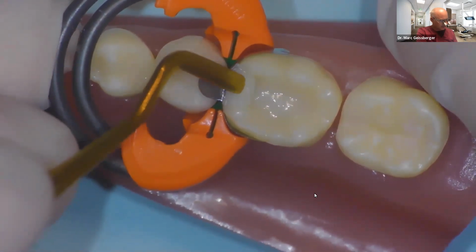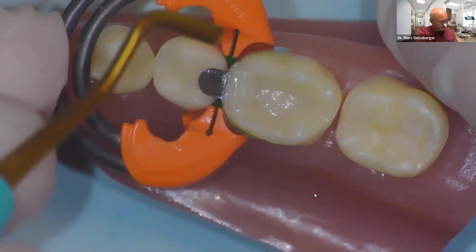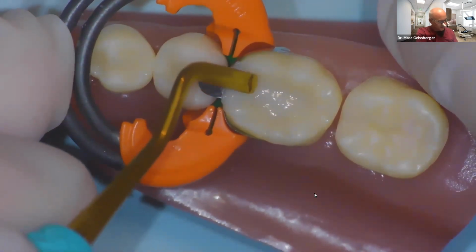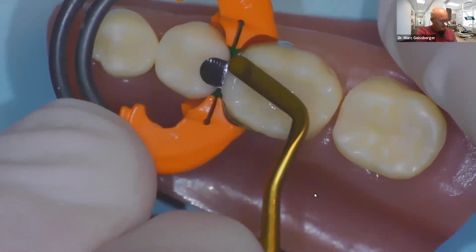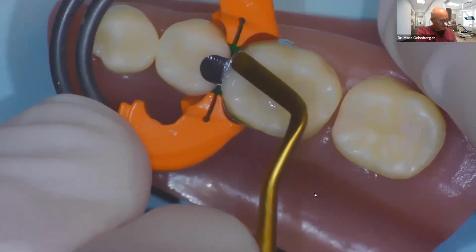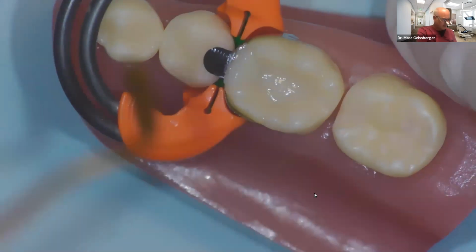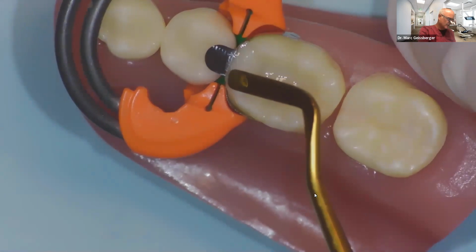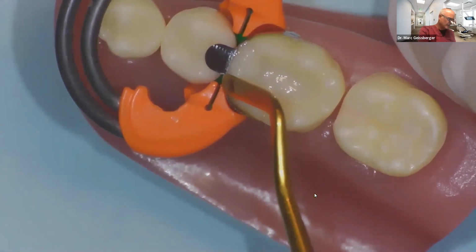And now I'm going to use the spatula side to start kind of condensing that up against the marginal ridge. I'll use this spatula to help me kind of clear excess, try and minimize the amount of excess on, and I'm filling right to the height of that matrix band.